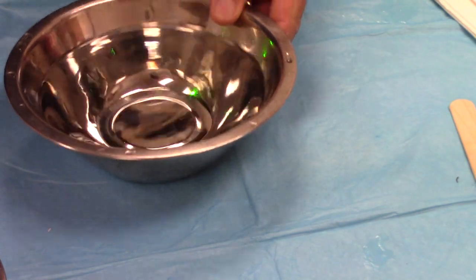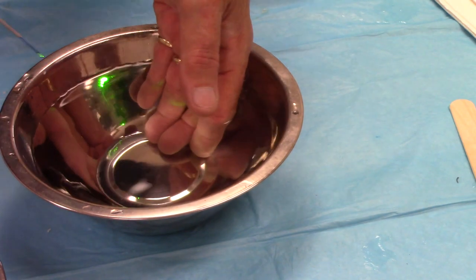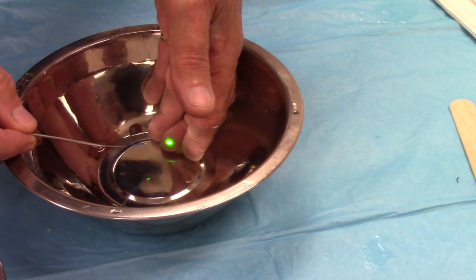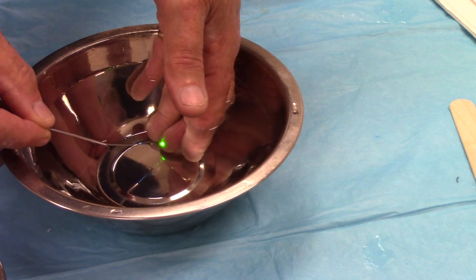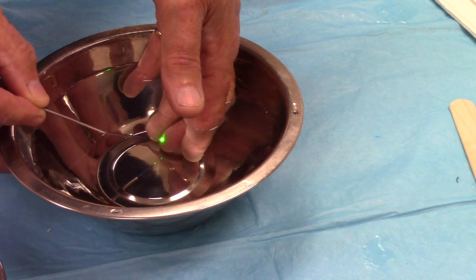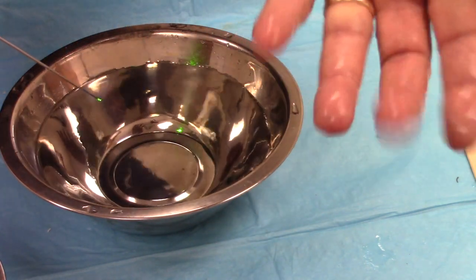Now let's do the same thing under fluid. I'm going to put my hand in here and then take the laser fiber, get it reasonably close. I'm not totally stupid — I'm not going to touch my finger with the fiber. But as it fires — there we go, 1.2 joules. I'm outside of that steam bubble, so I can't really feel anything at all. And I'm within less than half an inch away from my skin when I do this. I'm not burned at all.